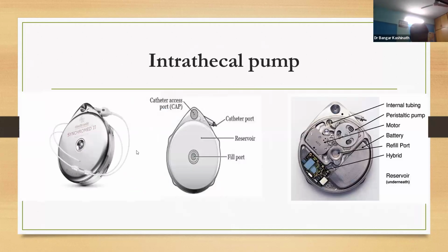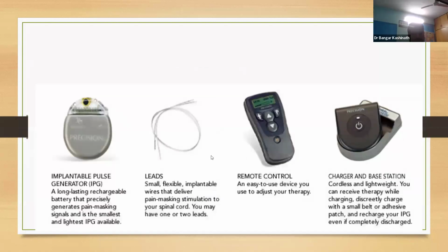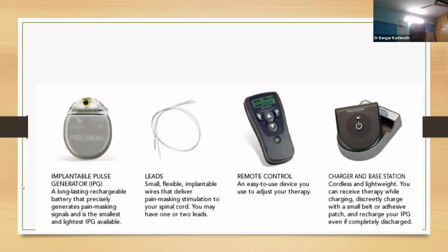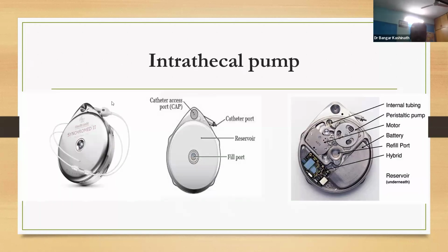have you seen the intrathecal pumps? No, sir. Okay, fantastic. So this device, you will be having two devices looking nearly the same, a little different. Just have a look at this. I will explain this. See, these are the two devices. One is the intrathecal pump. Lots of differences are there, but I'll show it. Primarily, the intrathecal pump and the spinal cord stimulator look the same. We'll see the difference. So this is an intrathecal pump.